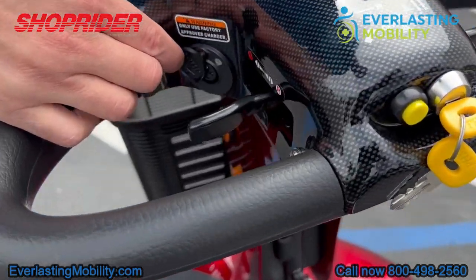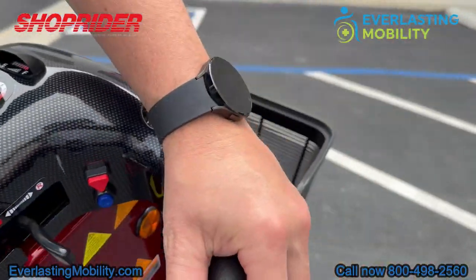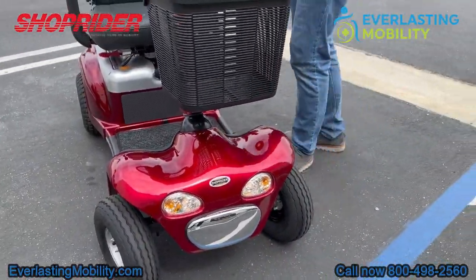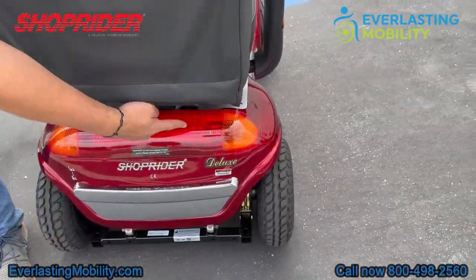The charging port is located directly on the tiller — up high and easy to access. On the other side of the tiller across from the charging port is your lighting package. You can turn on the headlights, and there are two headlights on the front and two taillights on the back as well.